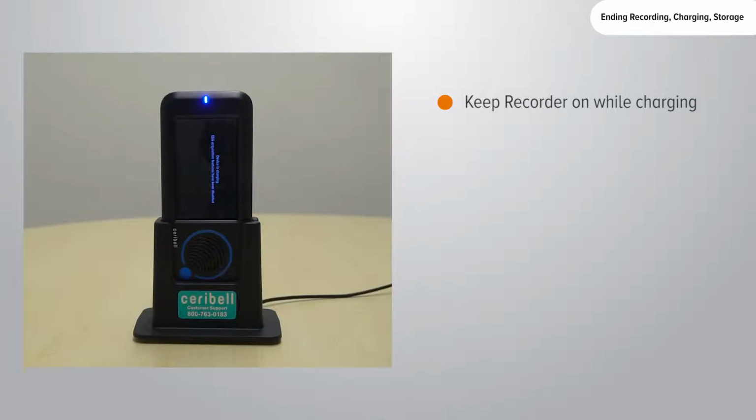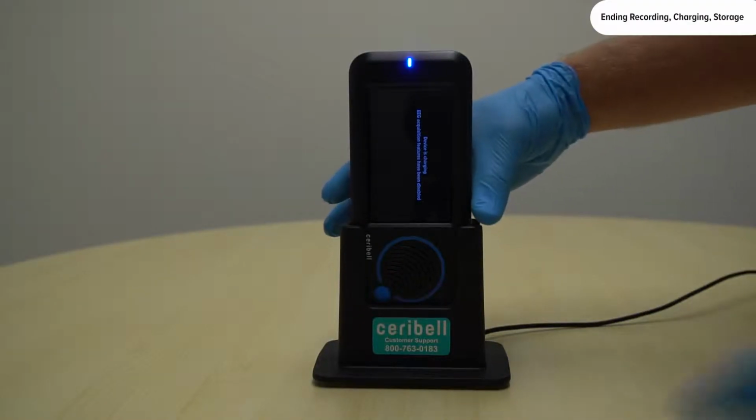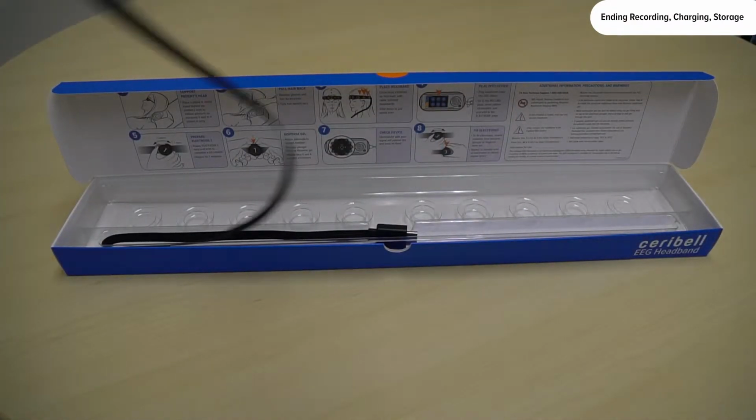It will typically take a couple hours to charge the recorder, but if the battery is completely empty, it will take 8 hours to fully charge. You cannot use the device on patients while it is being charged. After charging, the device is now ready to be used again with a new headband on another patient.